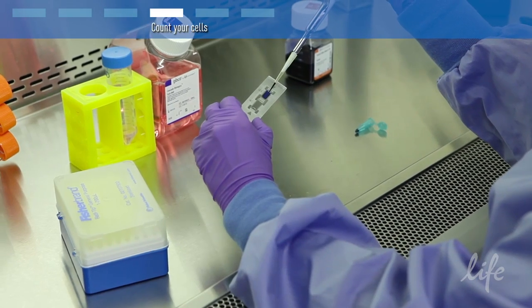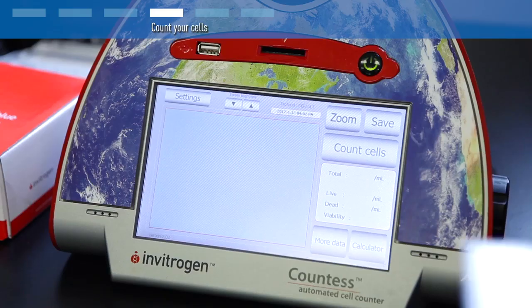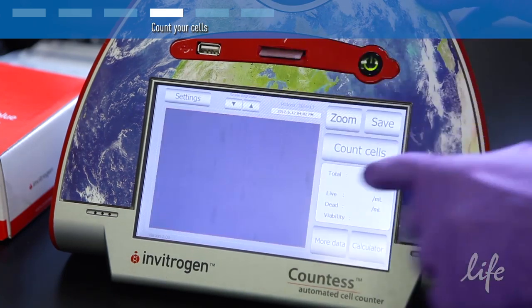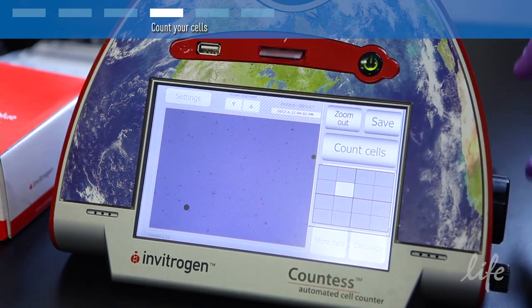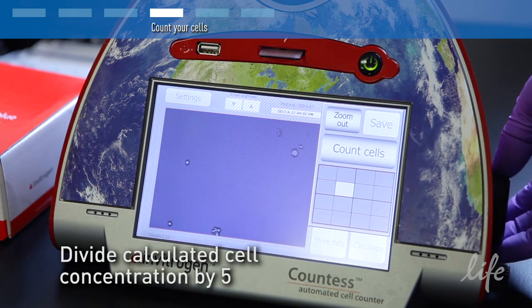Use a Countess automated cell counter or hemocytometer to determine the number of viable cells per ml in the cryovial. Remember that the calculated cell concentration should be divided by 5 because we diluted the original cell stock.